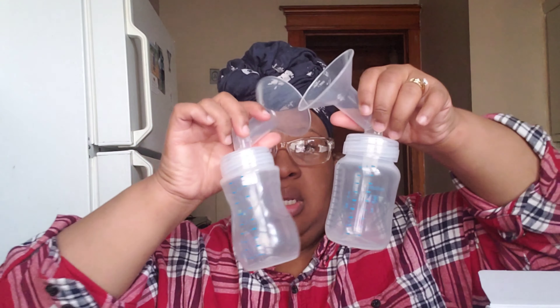What I'm using now are the Philips Avent bottles — they go up to nine ounces. As you can see, one is wider and chunkier and one is more tall and slim. These actually attach perfectly to the Spectra pump, so I use these instead of the Spectra bottles. I'm glad I found that out. I've been using the Philips Avent bottles with the Spectra pump.